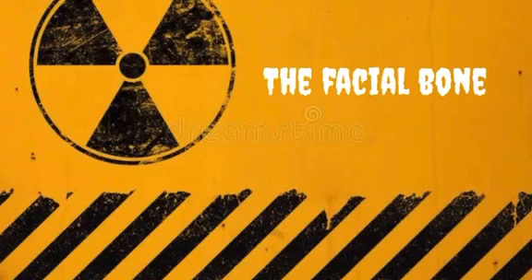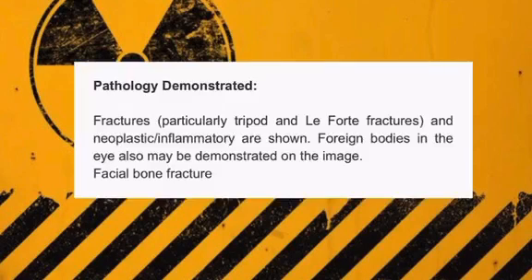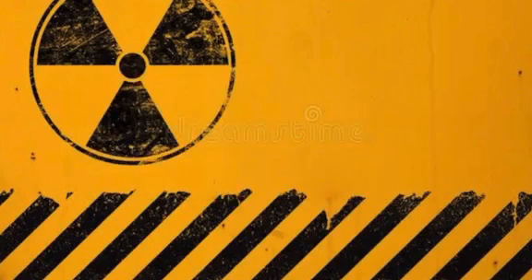The facial bone Waters method, parieto-acanthial projection. In pathology demonstrated, fractures, particularly tripod and Le Fort fractures, and neoplastic or inflammatory processes are shown. Foreign bodies in the eye also may be demonstrated on the image of facial bone fracture.